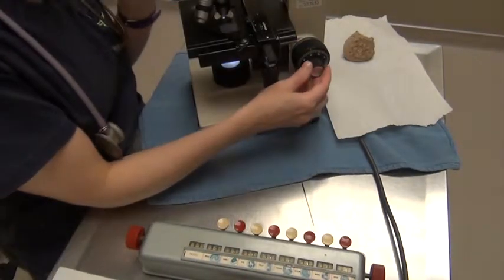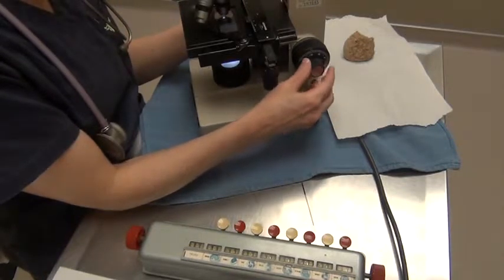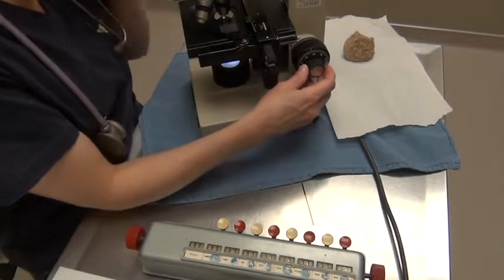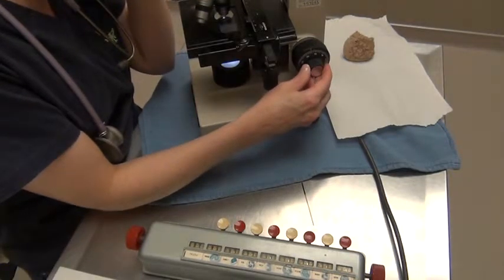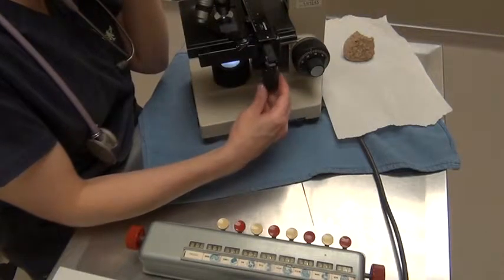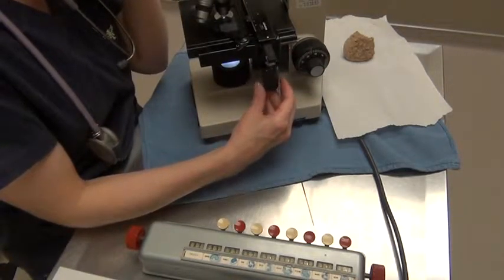Alright, we're going to go ahead and start focusing on 100. I did put the immersion oil in, and the high dry lens is down. Okay. So right now I'm going to find the edge of the monolayer, which I have found. I'm going to go back to an area of proper density.